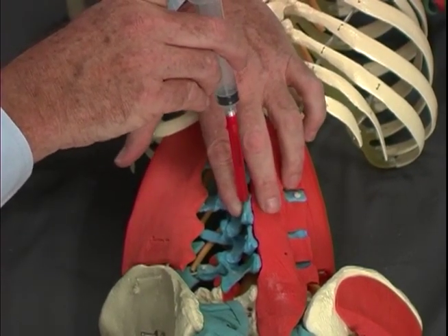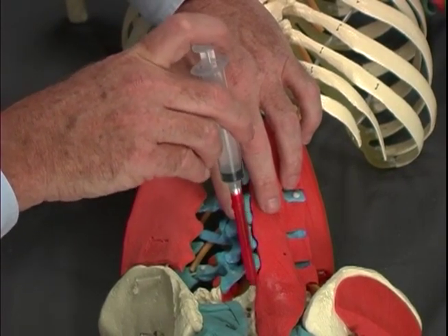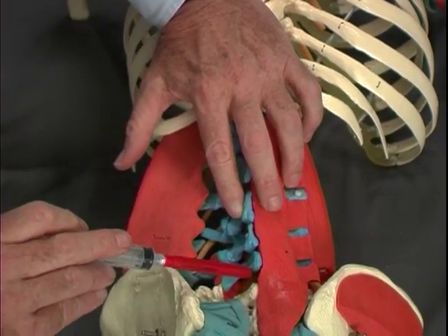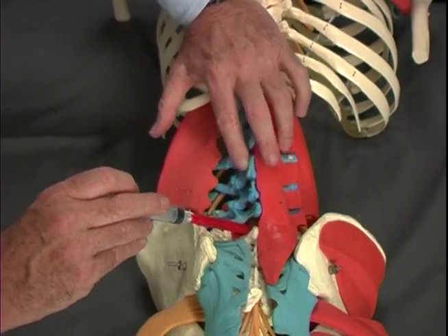Again, the next spinous process all the way down to L5, but being careful not to go into the area between L5 and S1 as the dura mater can protrude into this area, making it easier to do a spinal tap.